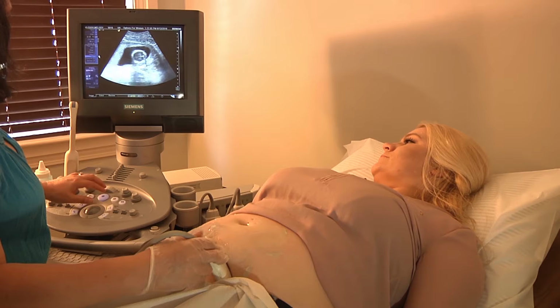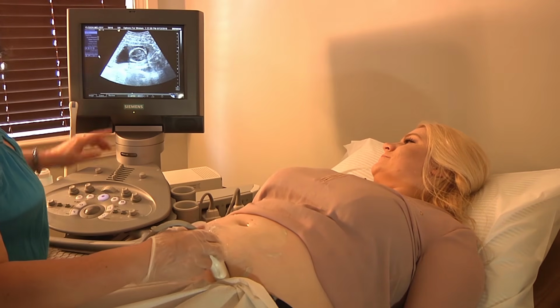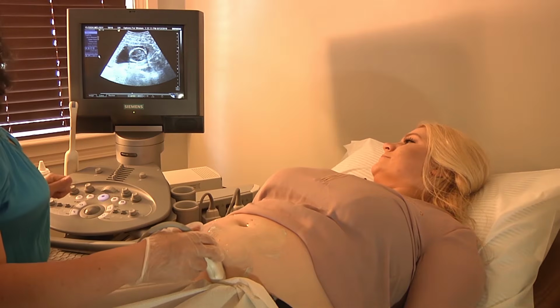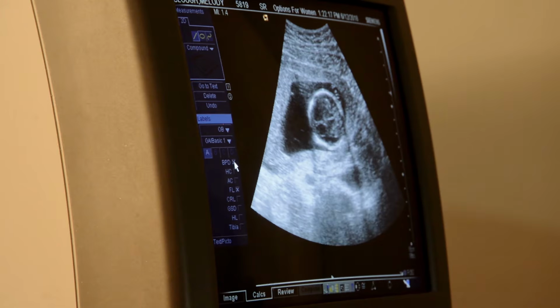Oh no, he's going to move. I might take that one. Not bad. Yeah, that's pretty good. It's much easier with this method than the way I was using it. Good. Because now I realize they never gave us the direction before about the brow up and the brow down. They just said go to the spine, and I never realized why it wasn't working.